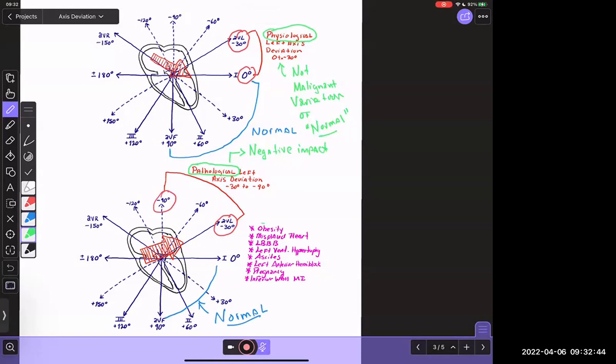Why would that be? Why would obesity cause a left axis deviation? The heart is misplaced in the body. It's turned. It's okay. Hypertension, maybe, and usually they have left ventricle hypertrophy. Okay, I will tell you. All right. So let's go with the first answer about the heart's location in the chest cavity.